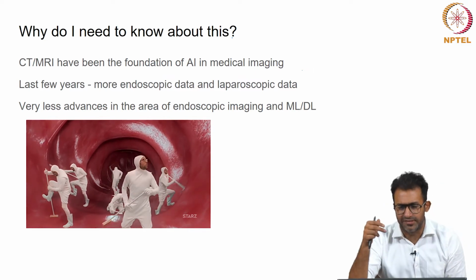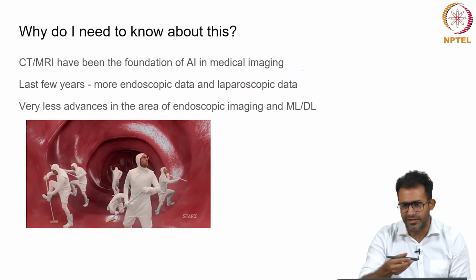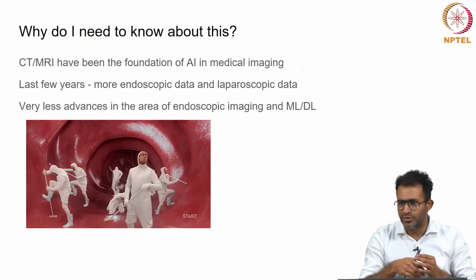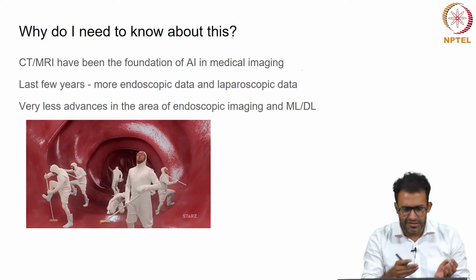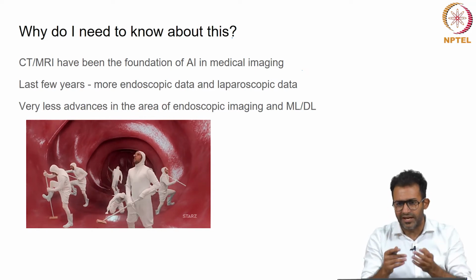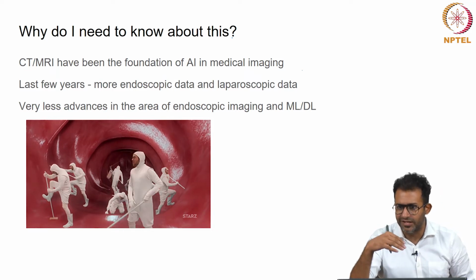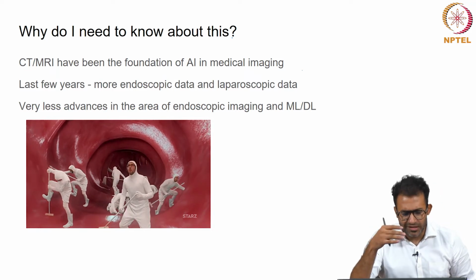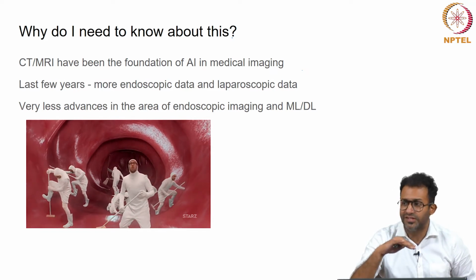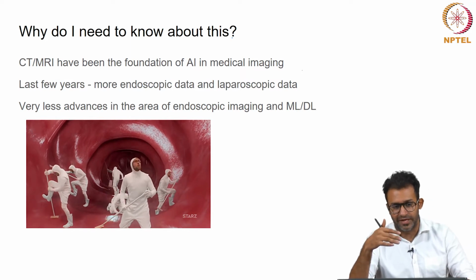unlike endoscopy or laparoscopy, where there is a lot of operator dependence. The way I handle the camera is going to be very different from the way my other surgeon handles it. The way I place the instruments is going to be very different. I might have my own personal preferences, but that's not the case in CT or MRI, where the machine takes a scan, and only the interpretation is left to the radiologist, and that's where AI has played a major role. But over the last few years, the number of endoscopy and laparoscopy cases has increased exponentially as more surgeons are having access to laparoscopy and endoscopy.